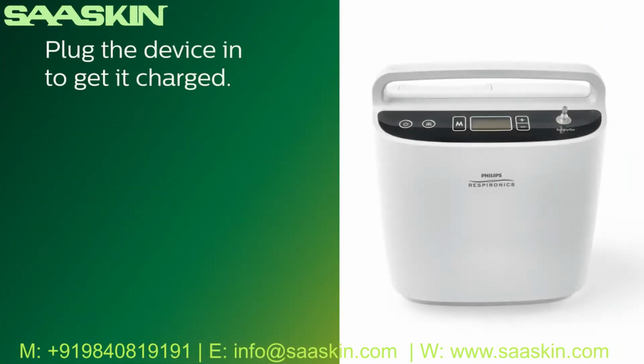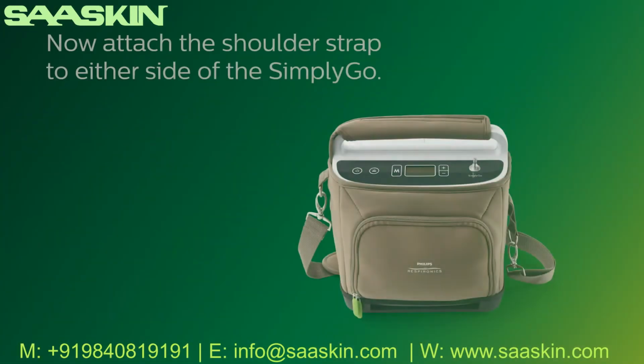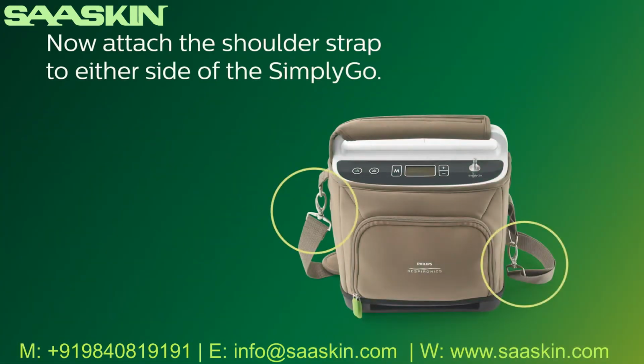One of the first things you'll want to do is plug in the SimplyGo to get it charged. The battery may come partially charged, but it can take up to 4 hours for a complete charge. Now attach the shoulder strap to either side of the SimplyGo.